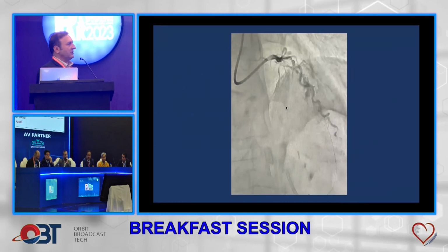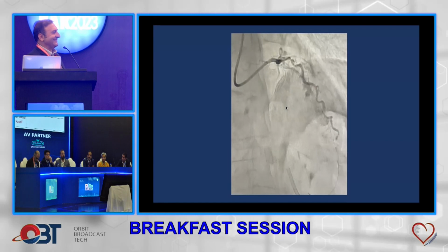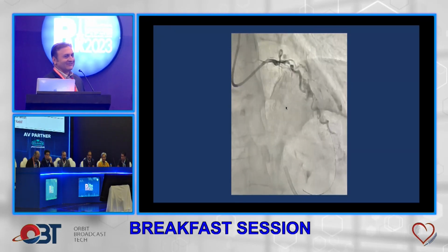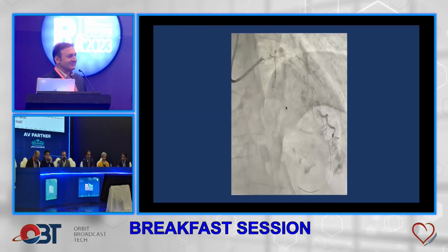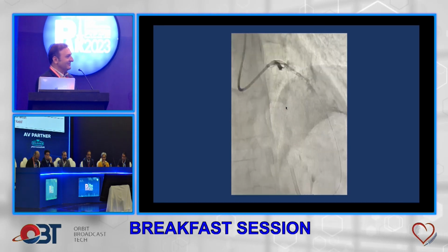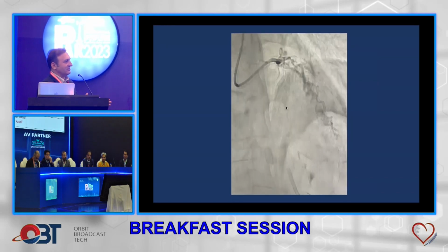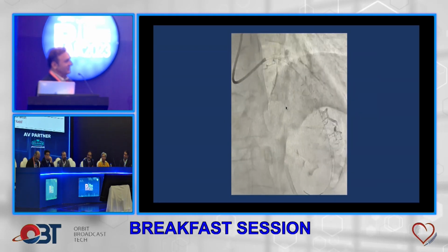So this was after. Were you sure that your wire is in the distal LAD? That would be my other concern. Yeah, this is a question for you. Where is my wire? I would have been very reluctant to balloon further unless I am 100% sure that my wire is in the lumen and not somewhere outside. And it looks like this may not have been in the lumen and you ballooned, and that probably made it further worse. I told, because I had almost exhausted all the options, and the surgeon was not very keen, and the lady was very frail, and this wire is in the pericardial space.